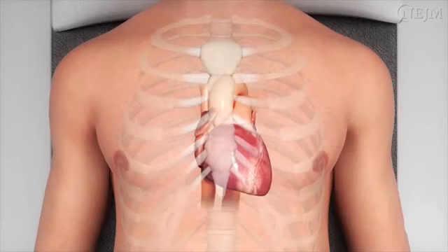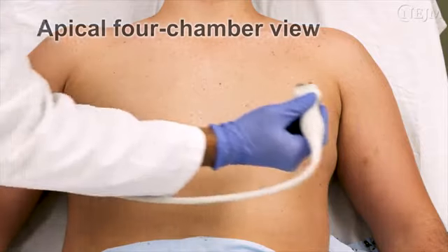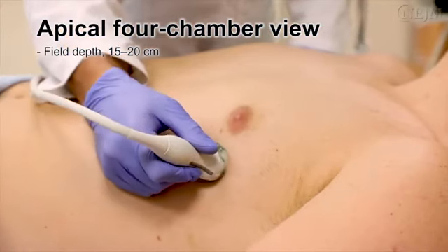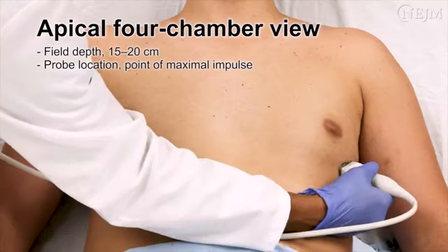The most validated echocardiographic views for the visual assessment of the left ventricular systolic function are the apical four-chamber view, the parasternal long-axis view, and the parasternal short-axis view. To obtain an image in the apical four-chamber view, set the field depth between 15 and 20 centimeters and place the probe at the point of maximal impulse.